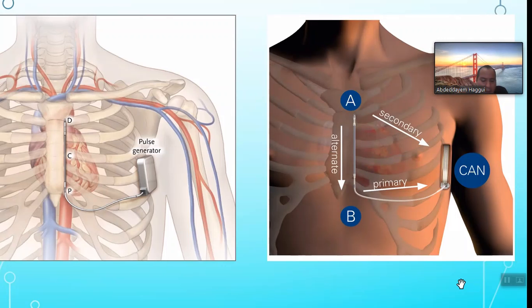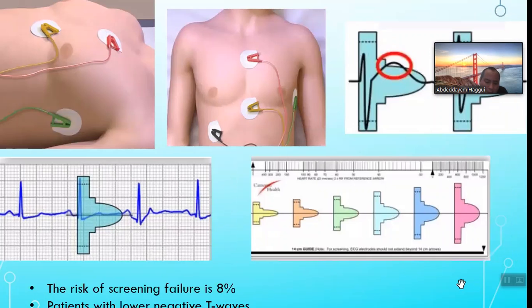These vectors enable the analysis of the cardiac electrocardiogram. But before deciding the implant of an SICD, it's essential to do a screening. Screening is used to check whether the patient has a suitable signal for the proper functioning of the SICD, thus allowing the best sensitivity and specificity of the identification of the rhythm and reducing the risk of oversensing, which is the main cause of inappropriate shocks.